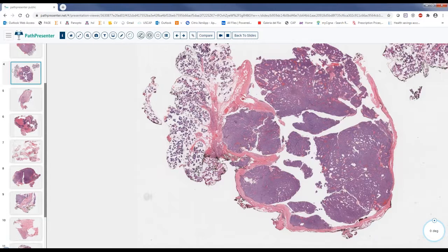Usually we don't see matrix in basal cell adenoma. Usually we see small basaloid cells, and usually it's an elder population rather than younger. For the membranous type, we look for skin; the counterpart could be coming from skin. Simple excision is usually curative for the lesion.